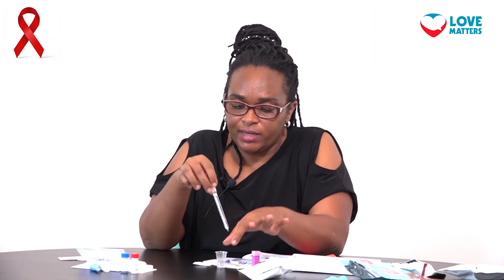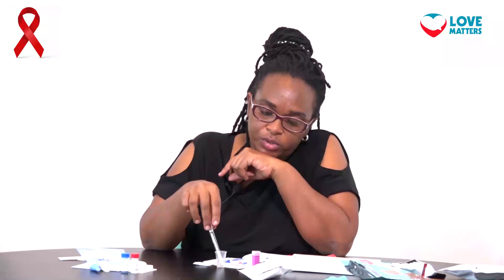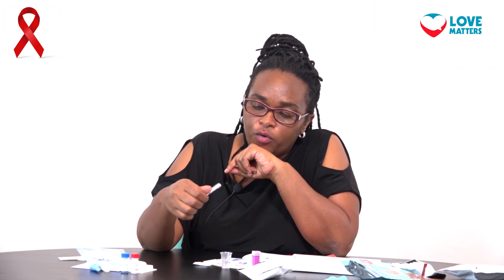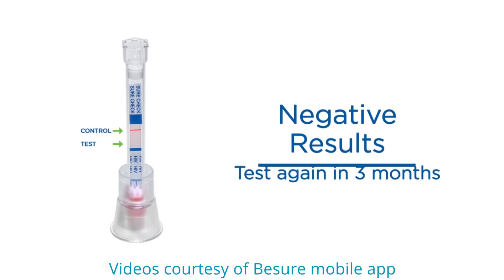Once you remove the blood you put it inside here in this well, and then you're supposed to see some color changes going up to show whether you have HIV or not. For every test, two lines will interpret a positive result and one line will interpret a negative result.